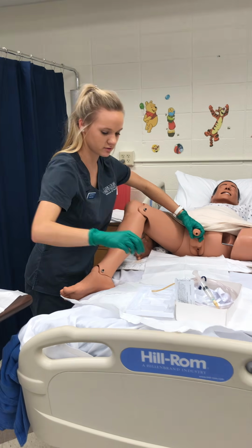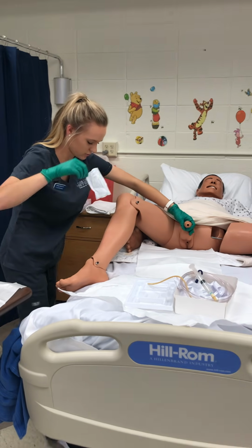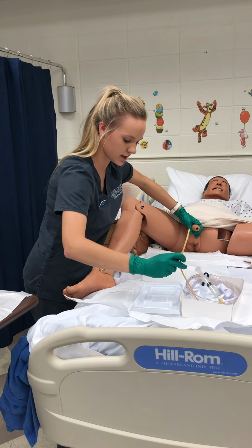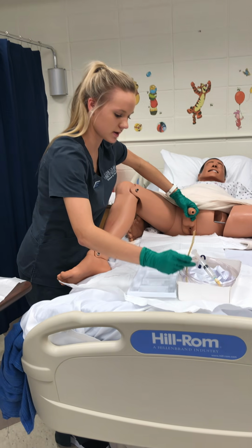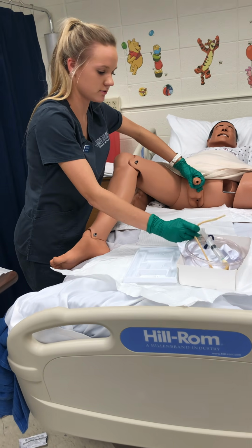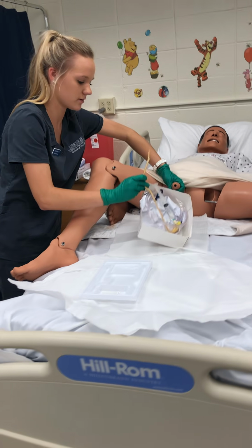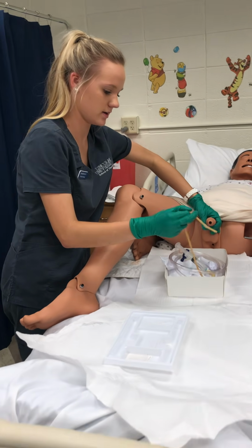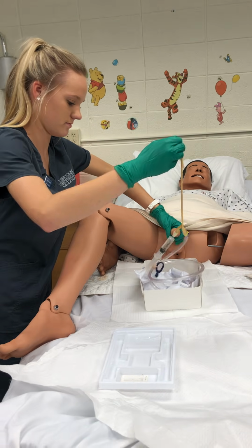Perfect. Okay, so now I'm going to go ahead and pitch this as well. Don't need it. And then I'm going to go ahead and get my catheter ready to insert. Move this closer to me because I still have my 1-inch border. I'm going to go ahead and wrap this up.